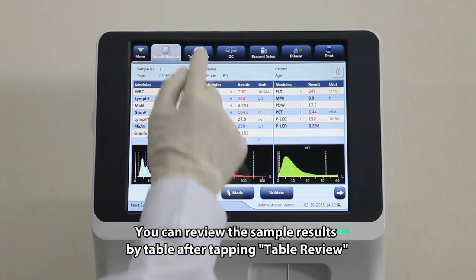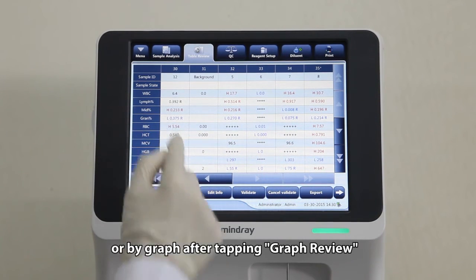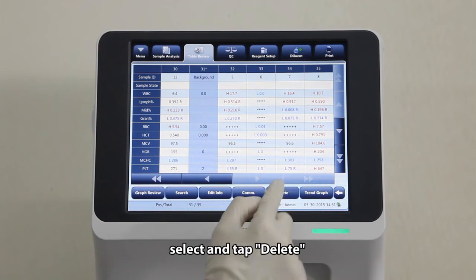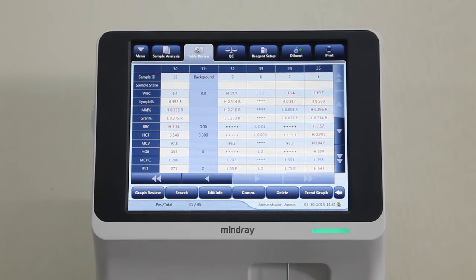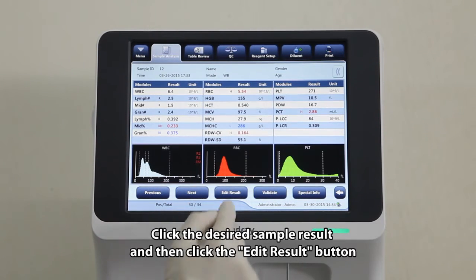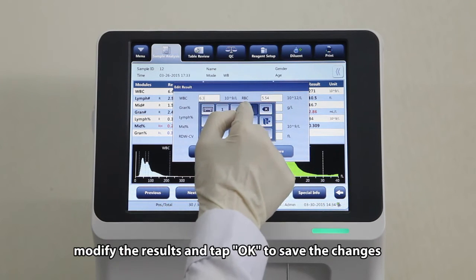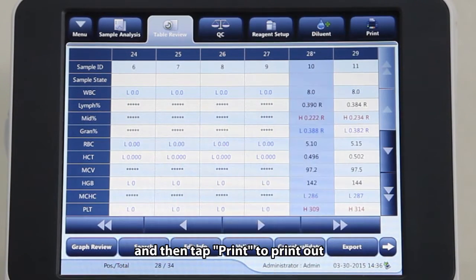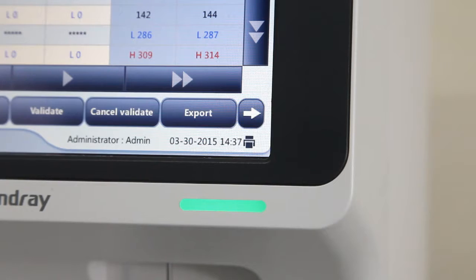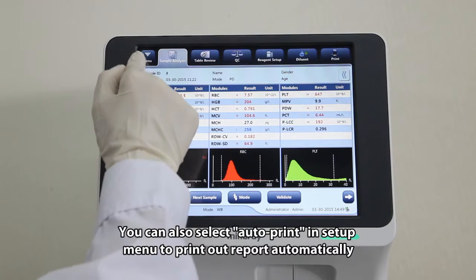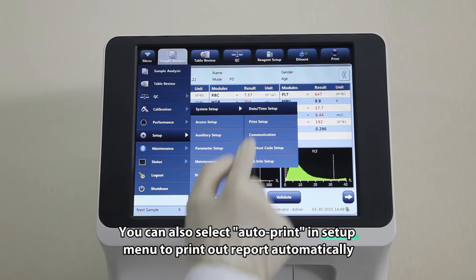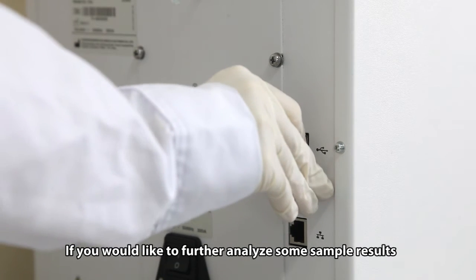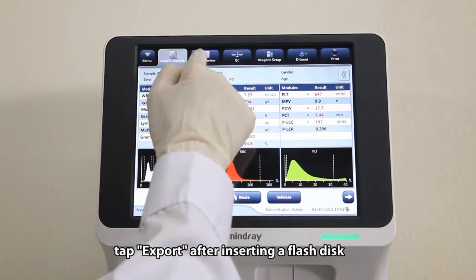You can review the sample results by table after tapping Table Review or in graphs by tapping Graph Review. For unwanted sample results, select and tap Delete. Every sample result is editable. Click the desired sample result and then click the Edit Result button. Modify the results and tap OK to save the changes. Select sample records to be printed and then tap Print to print out. You can also select Auto-Print in Setup Menu to print out reports automatically. If you would like to further analyze some sample results, tap Export after inserting a flash disk.